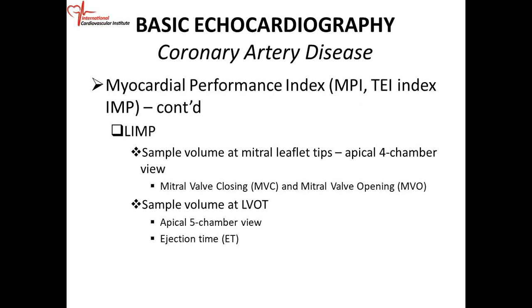So pulse wave Doppler assessment, apical four-chamber view, cursor is across the mitral valve. The sample volume is at the tip of the mitral leaflet. The definition is mitral valve closure to mitral valve opening minus ejection time divided by the ejection time.